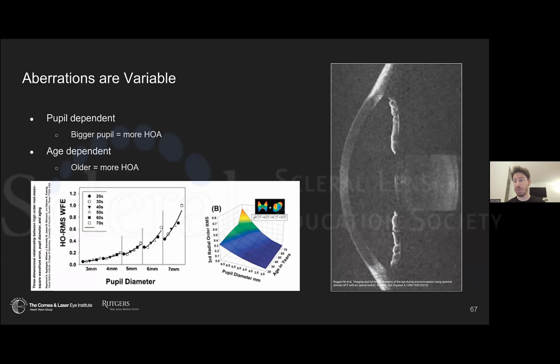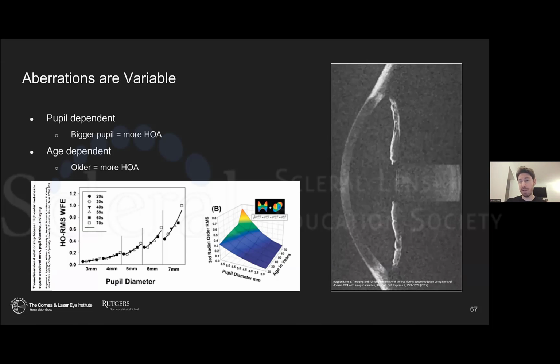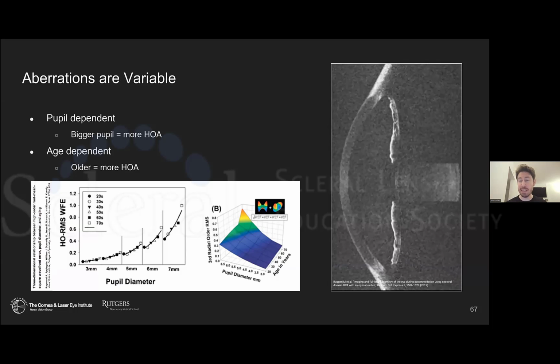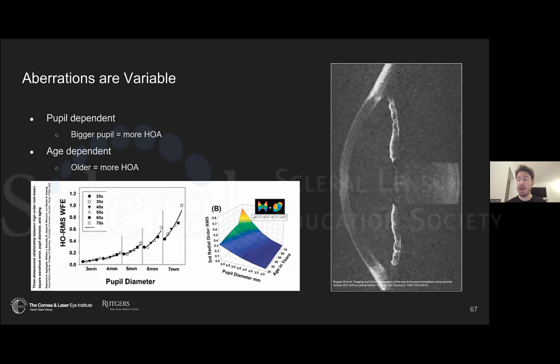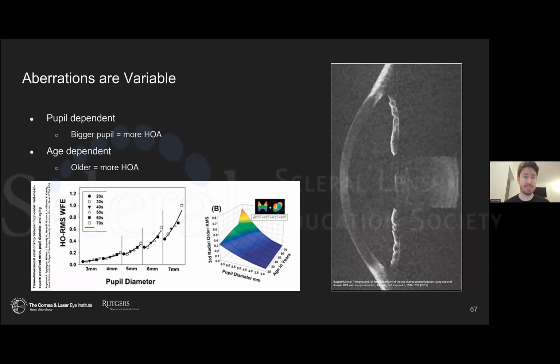And then, just like with any other device, let's say I'm measuring my aberrations on an Ovitz device, and Barry's measuring his on an OPD3, and you're measuring yours on an iTrace, and another person is measuring theirs on whatever other systems there are. Those are not going to be apples to apples measurements either. Obviously, if I take several measurements on the same device, we should have general agreement within those. But these are all the factors we have to think about for these individuals.